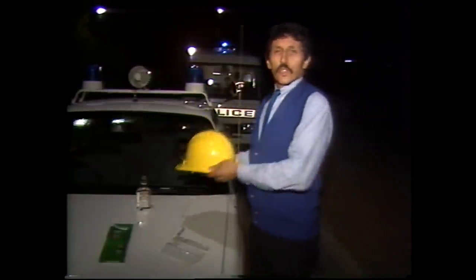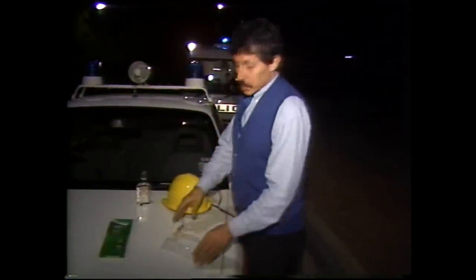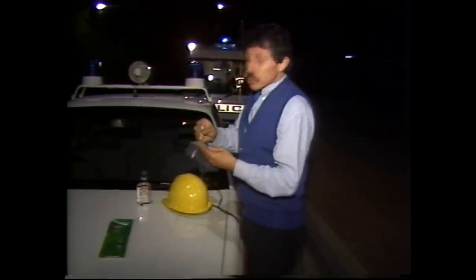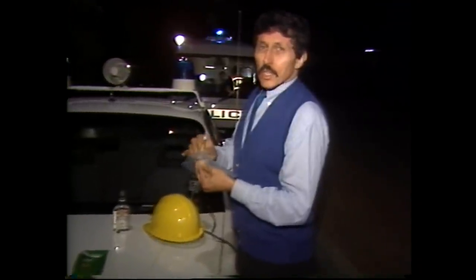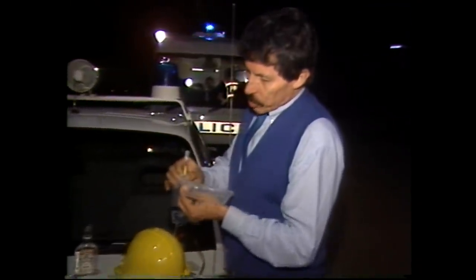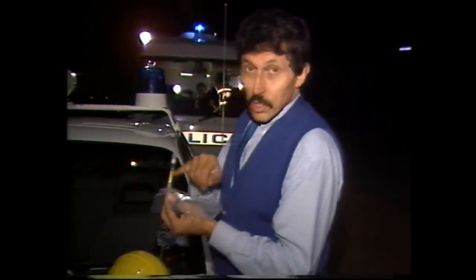Those systems are electronic — what happens if they don't work? The police officers go back to the old puff bags. An interesting method, which is fairly accurate, and it's fascinating to watch because it depends on changes in coloured crystals. You're asked to blow through this glass tubing into a plastic bag for six seconds, to see if there's any colour change in the orange crystals.